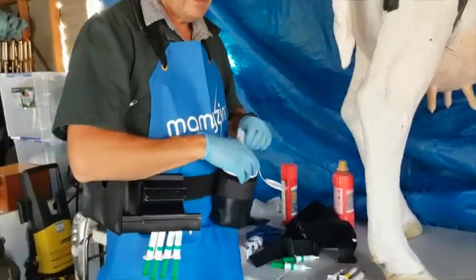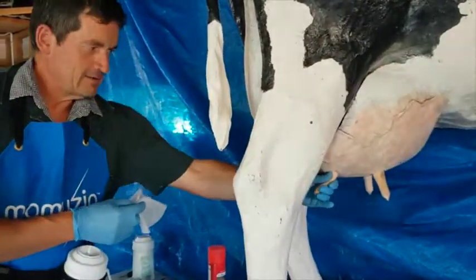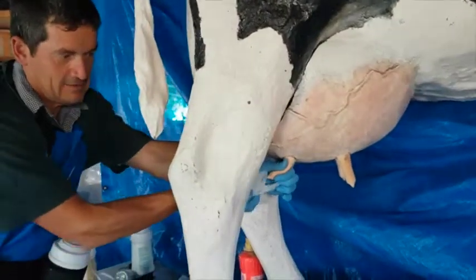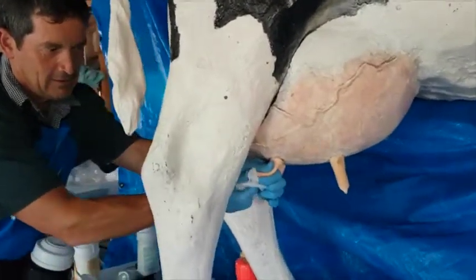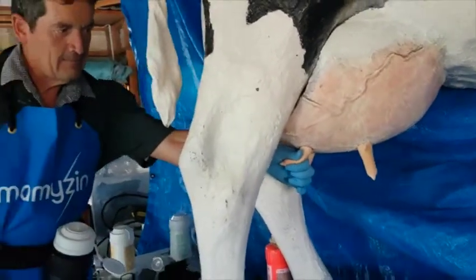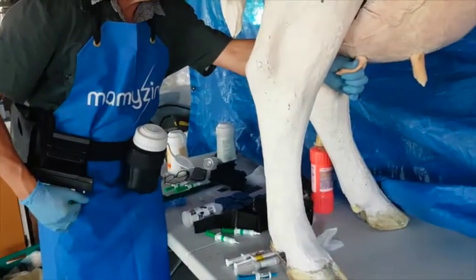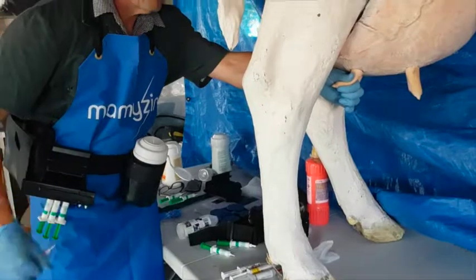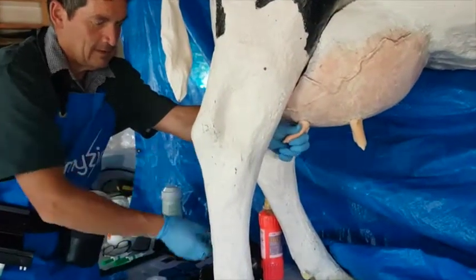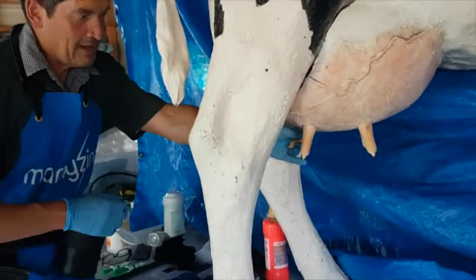Here I am now cow side. The big thing about this system is that you can retain contact with the target teat — never letting it go — making a good job of cleaning it with teat wipes. My eyes and hands are on there, and when it comes to grabbing the teat seal tube, I can reach back without even looking, grab it out with the cap off, insert it, and then quickly move to the next teat without looking back anywhere.